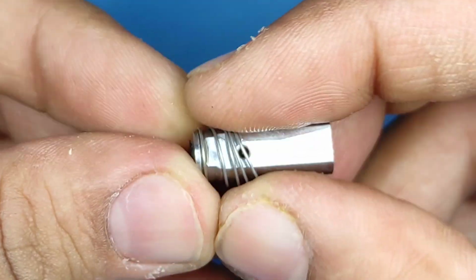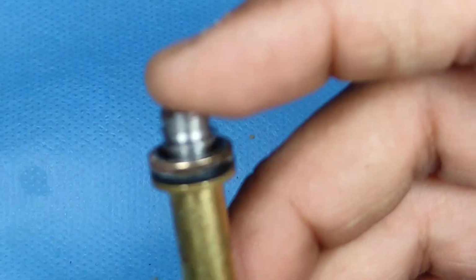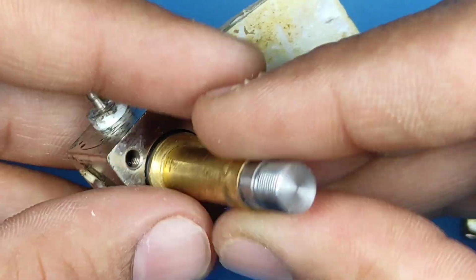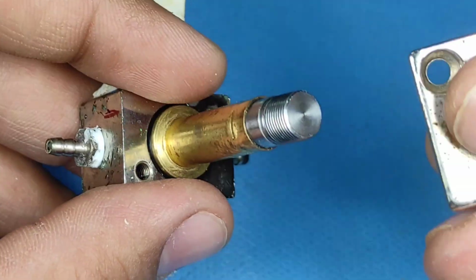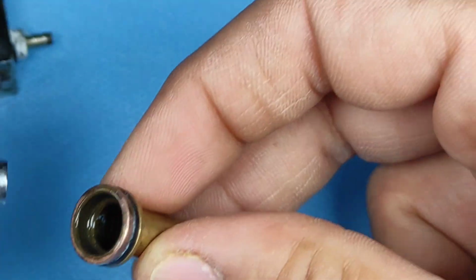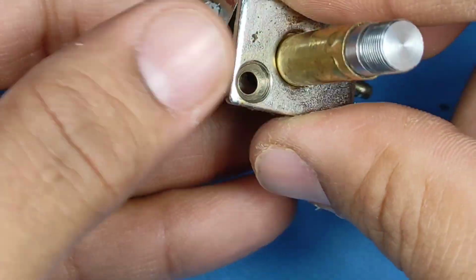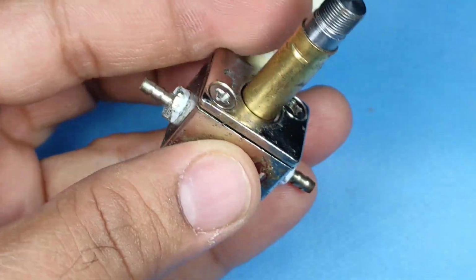So our spring is back again on our piston for our solenoid. Okay, it will go inside this cylinder for our piston. Okay, and here we are going to get it attached. We are now on our work to close the solenoid. Okay, I was able to find some stains over here, but they were just mild corrosions, nothing to worry much. Okay, so again I'm reassembling all the components, and we are trying to close our solenoid again, and hopefully it functions well. So I've tried to tighten the screws on both the sides.